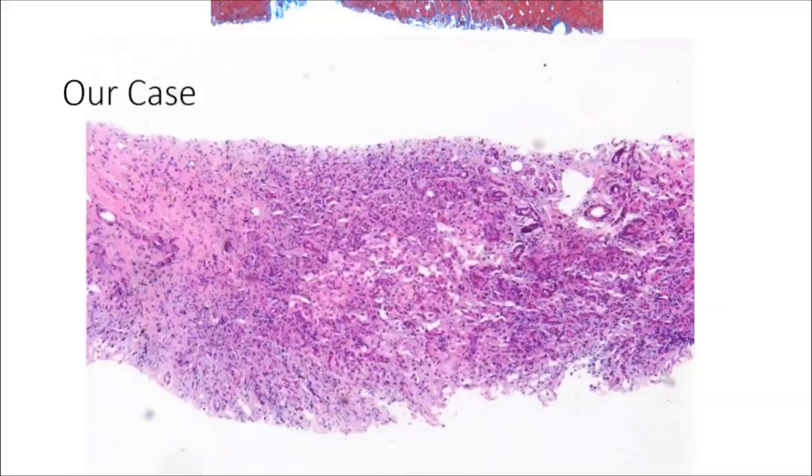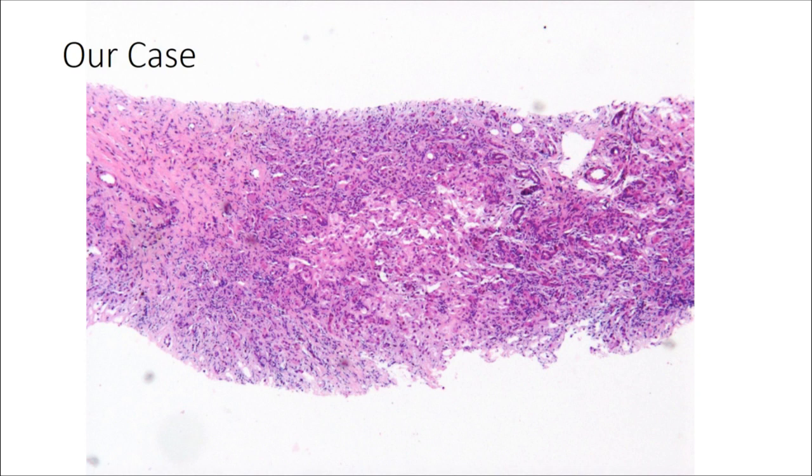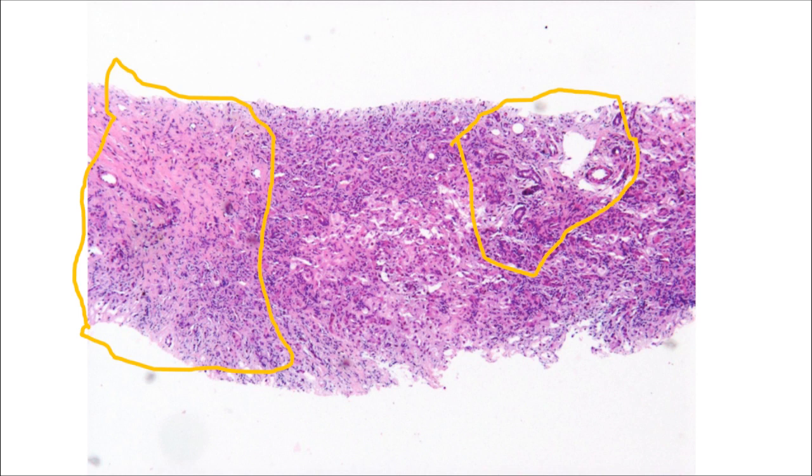Turning to our case now, this is the liver biopsy from the patient initially presented. And I think what we can see at low power is it looks nothing like one expected from pure venous outflow obstruction. And in particular, the yellow lines now, the circled areas, show you the portal tract areas. And what one can see if one focuses on those, that yes, in point of fact, there's bile ductal proliferation. The portal vein, in fact, yes, has diminution in its caliber, change in size. The hepatic artery is present, and there's not much in the way of inflammation. And so one may say, well, that may be perfectly compatible with what I just showed you.